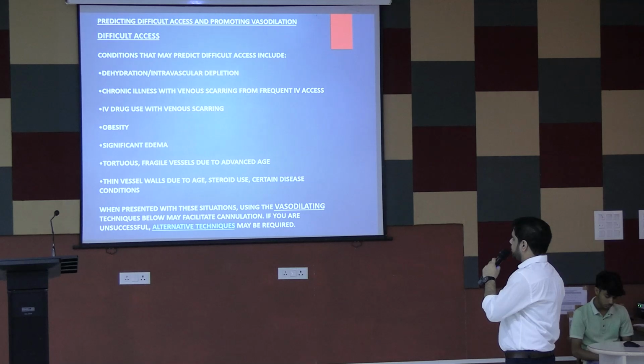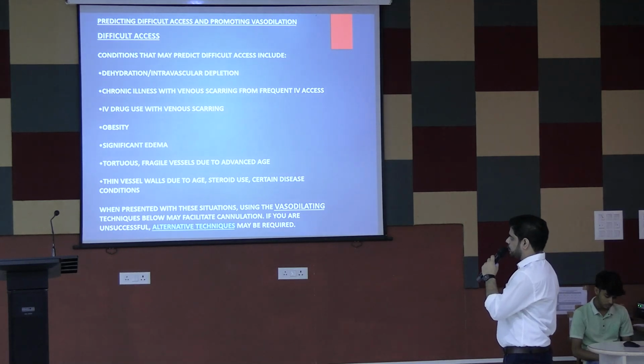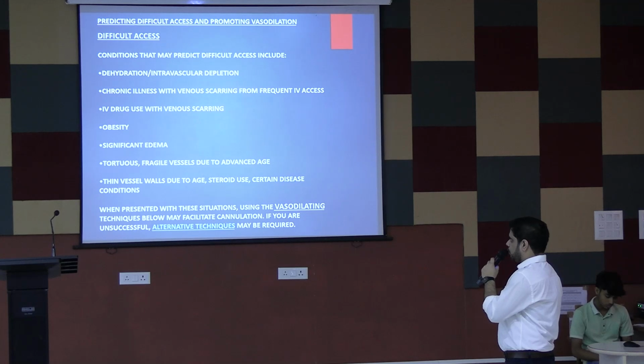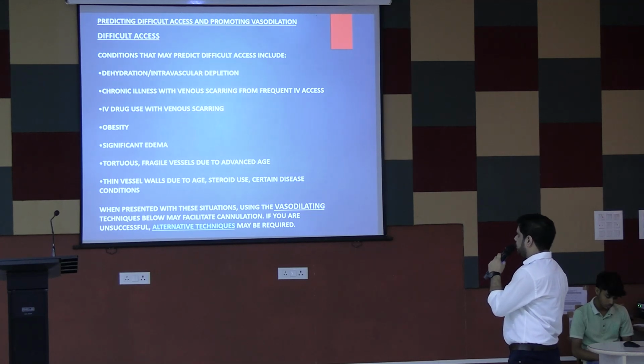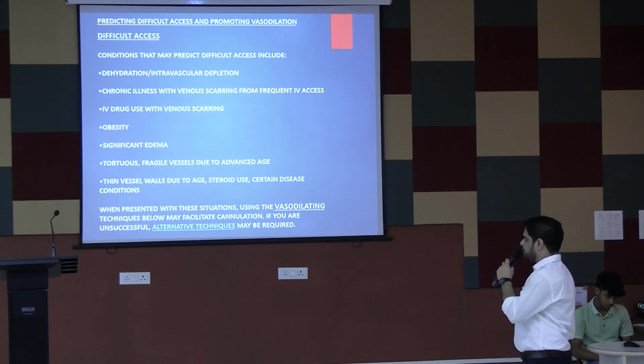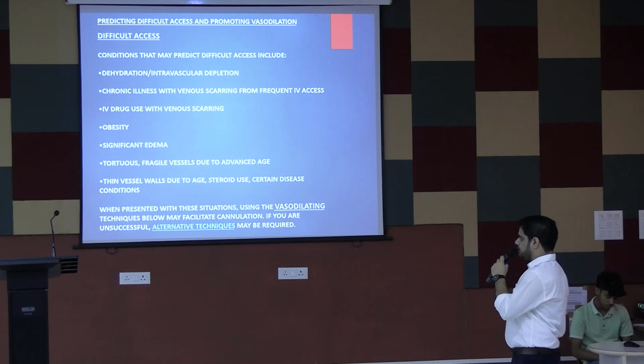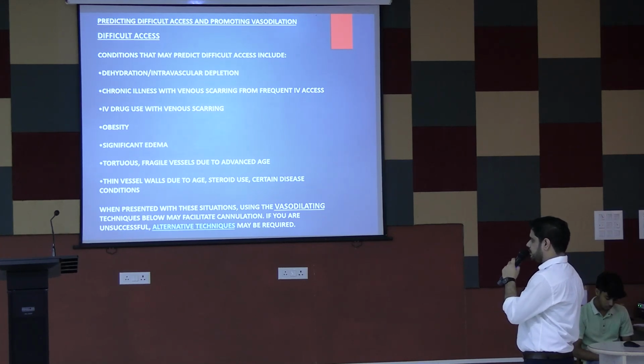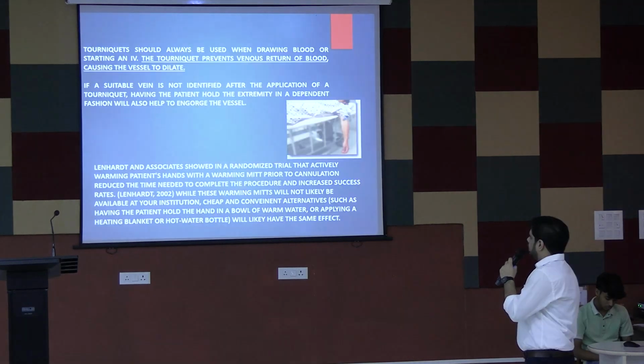Predicting difficult access and promoting vasodilation. Conditions that may predict difficult access include dehydration, chronic illness, venous scarring from frequent IV access, IV drug use with venous scarring, obesity, significant edema, tortuous fragile vessels due to advanced age, thin vessel walls due to age, steroid use, certain disease conditions.